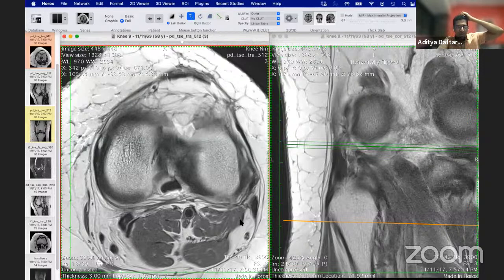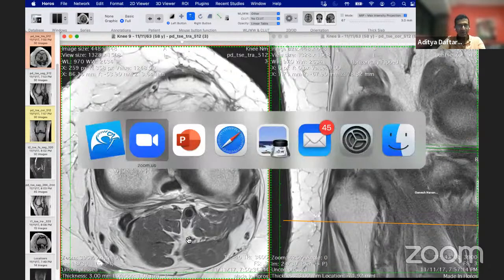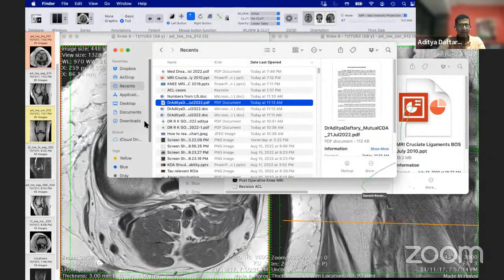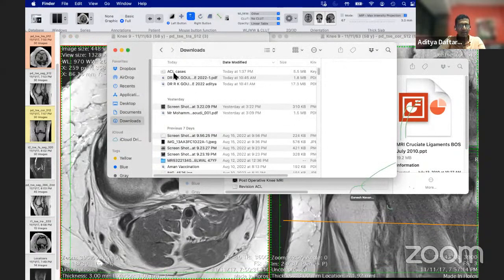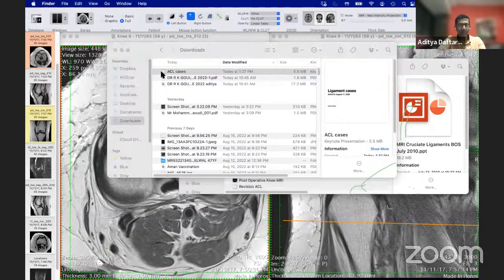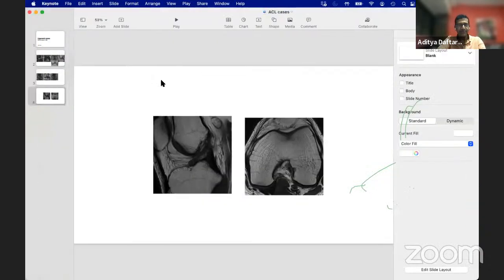If there are no more questions, what I'd like to do is maybe just go through a few cases and some images that might be helpful. I have a couple of cases that I put together just from recently. These were just some cases that I saw in the last 2 days that I thought would be interesting, and then I have some more cases also to look at.